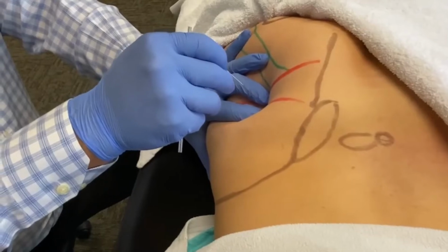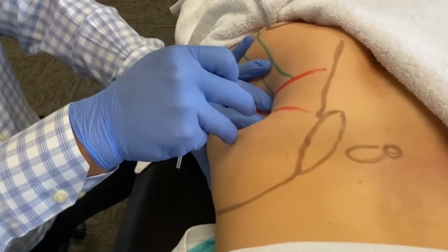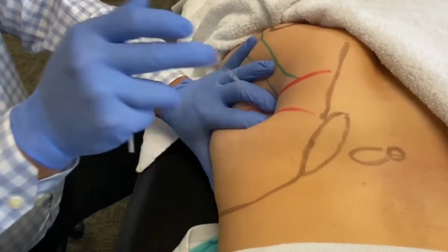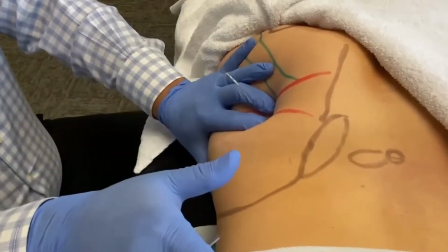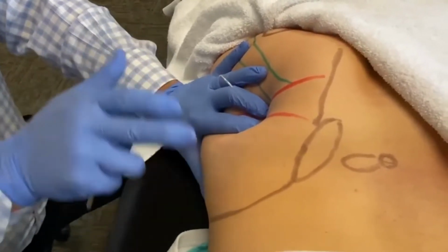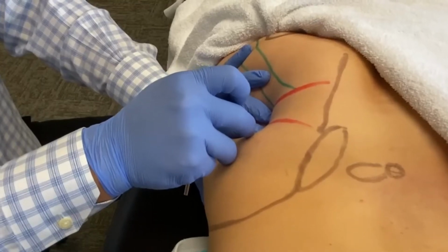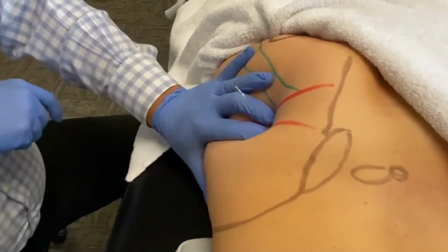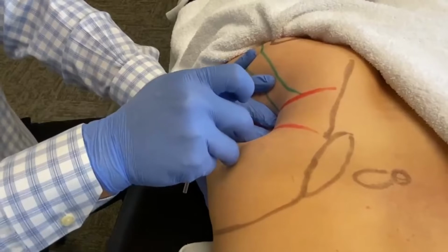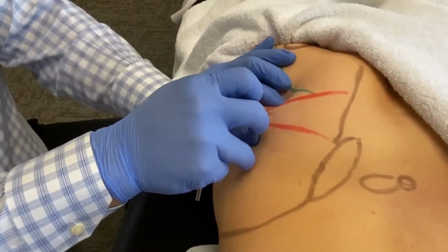Slowly advance the needle. Slow enough to allow your patient to verbalize any adverse response that you can adjust. Advance the needle until you get to the bony backdrop of the posterior femoral hip joint. Hold on to the needle and let the tissue recoil.